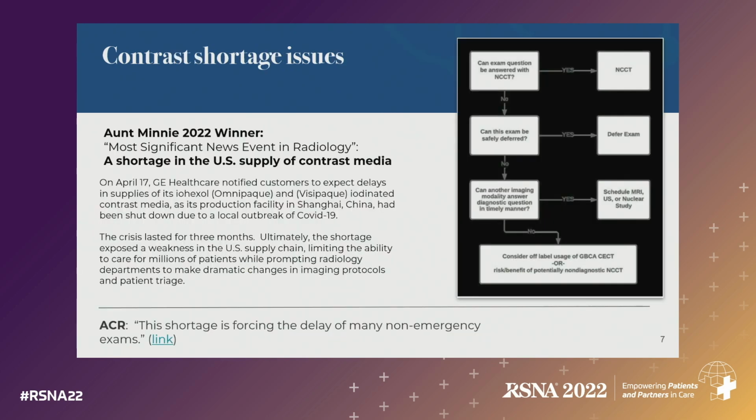Another motivation to reduce contrast media usage came to light during the supply chain disruptions caused by the pandemic. This specific shortage referenced here was for iodinated contrast media for CT scans, which is not an application I'll be showing today, but similar shortages could happen in GBCAs or PET tracers. Therefore, again, it is prudent to develop technologies that reduce reliance on materials that are sensitive to manufacturing disruptions.